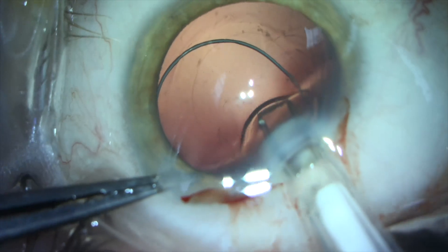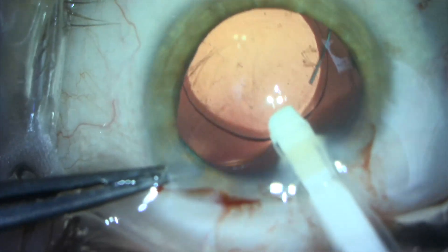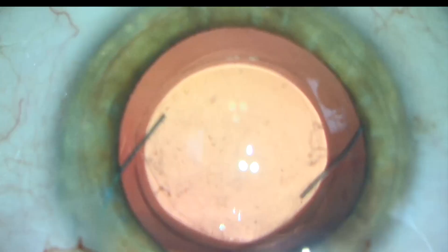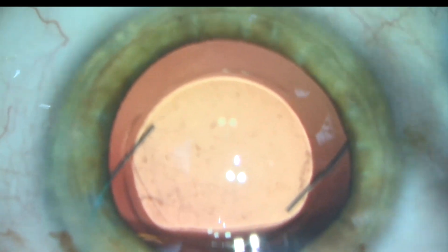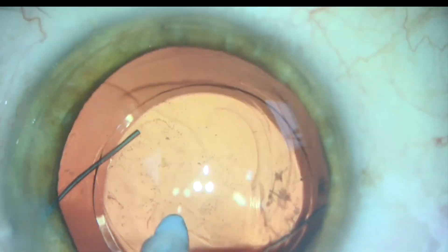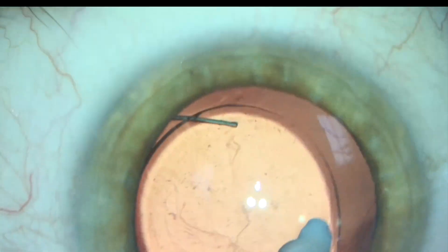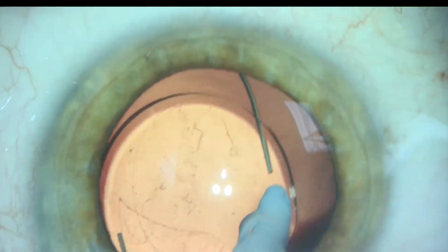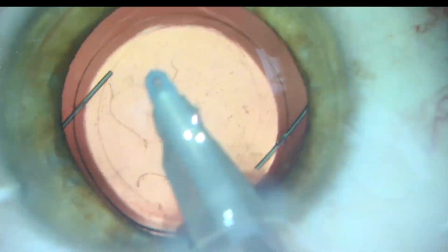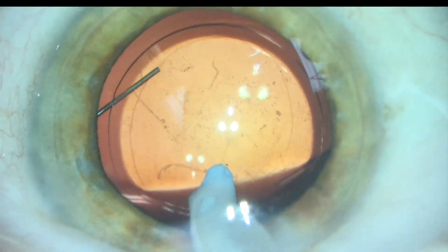We make sure not to polish the posterior capsule in the area where the posterior polar cataract plaque was, as it is weak and far more fragile than the normal posterior capsule of a normal eye. When we insert the IOL, we do it slowly to avoid trauma to the posterior capsule where the posterior polar cataract was. When we remove viscoelastic from behind the IOL, we go slow and gentle, making sure not to apply unnecessary pressure to the posterior capsule in the visual axis.